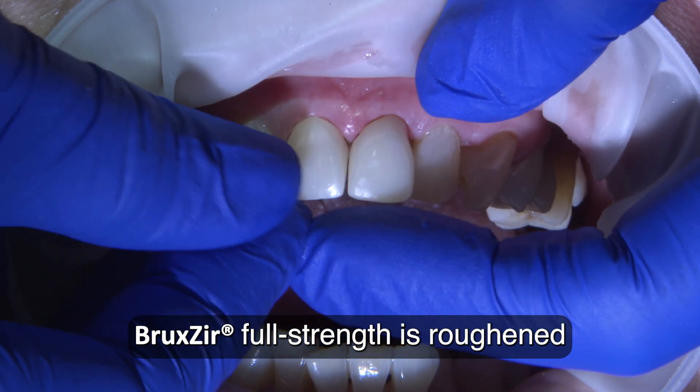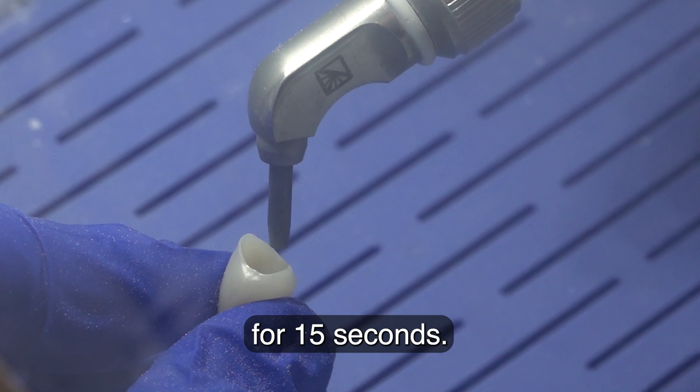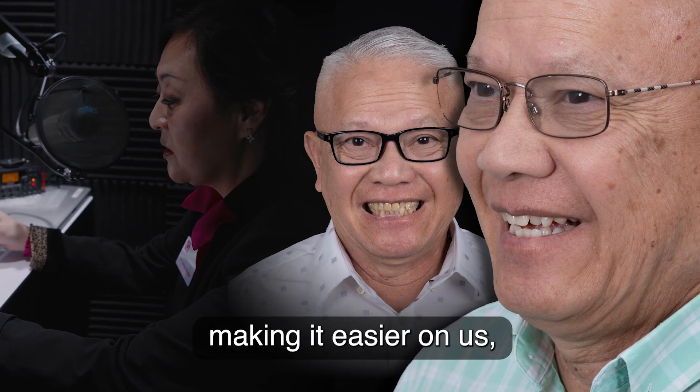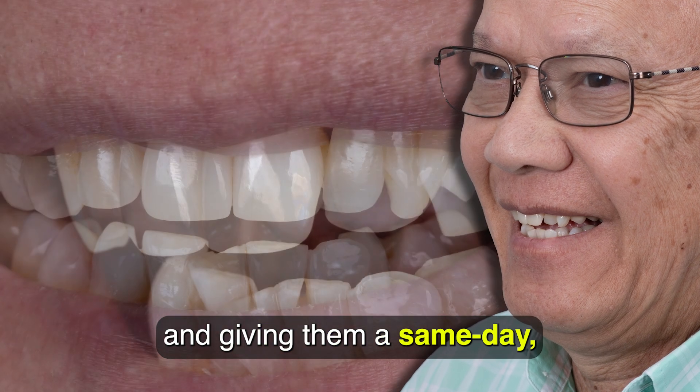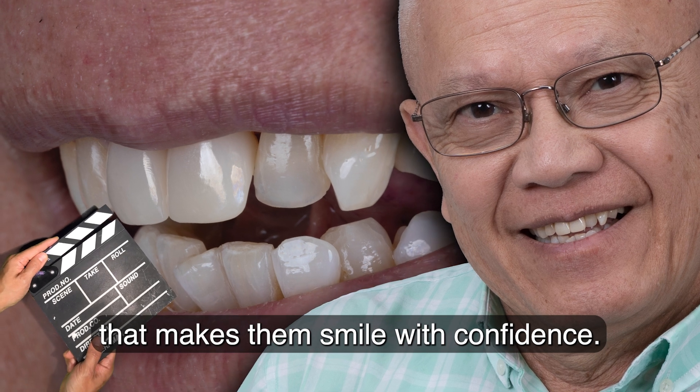BruxZir full-strength is roughened by blasting microns of aluminum oxide for 15 seconds. At the end of the day, it's not only about making it easier on us, it's also about making it easier on our patients and giving them a same-day, beautiful zirconia restoration that makes them smile with confidence.